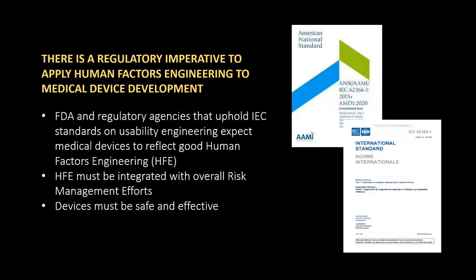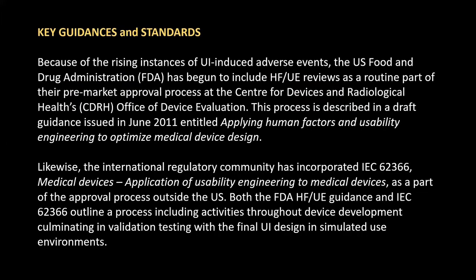But it's absolutely a necessity now and mandatory that these standards and guidances are included in risk management as we develop medical devices. So human factors and usability engineering sit alongside all of the risk management processes that we undertake in medical device development.